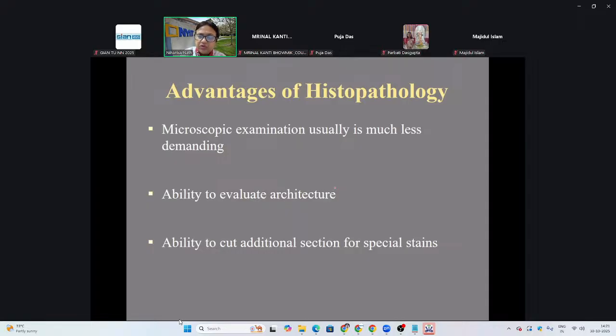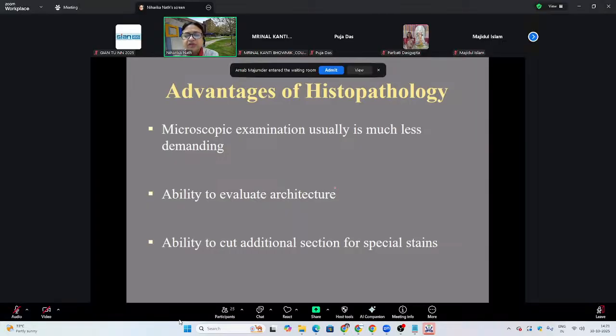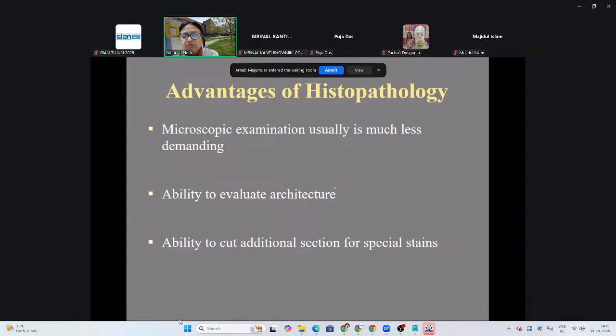And to do histology, it is like this. We have a section of the biopsy. We can just take another very close by section and simply add different stains and look at it differently. So we have the flexibility of being able to cut additional sections once the biopsy has been obtained, once the tissue is at hand. So, multiple uses.